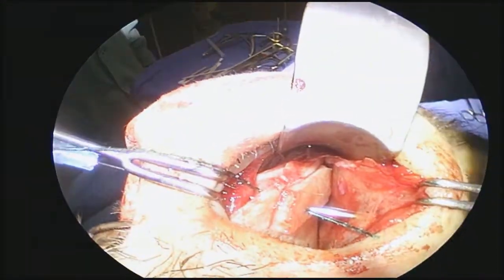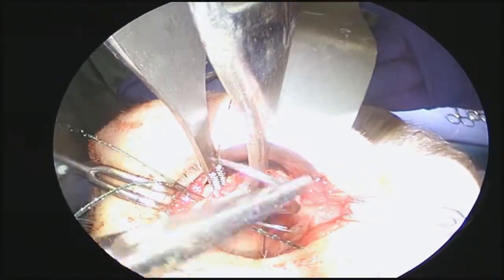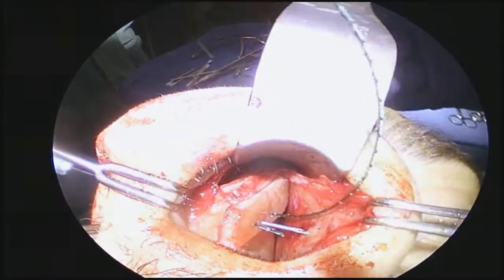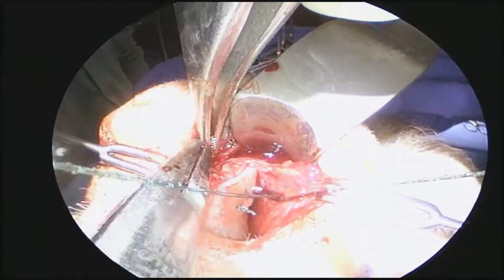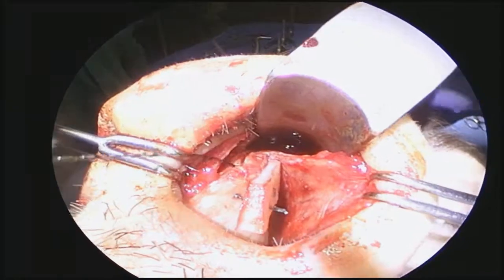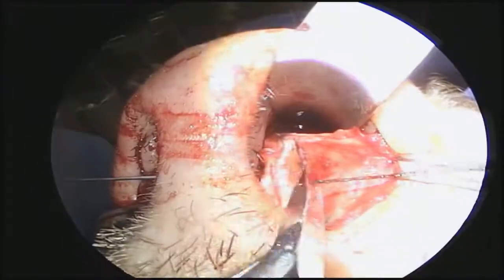Tying secure knots along spreader grafts in endonasal rhinoplasty with standard suture can be technically challenging because of limited exposure and visualization. Barbed sutures are effective and efficient devices that avoid the need for difficult knot tying deep in the nose, especially cephalically. There is no need to tie knots, so the suture ends are simply trimmed.